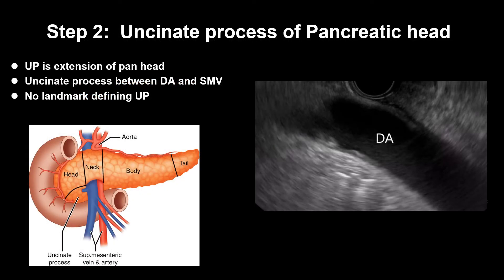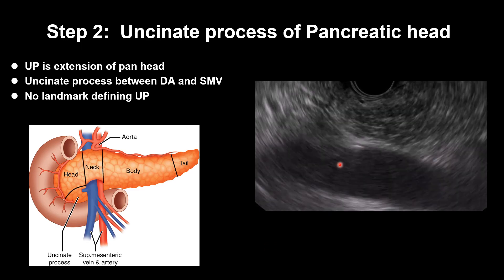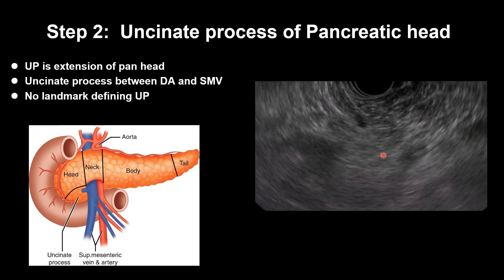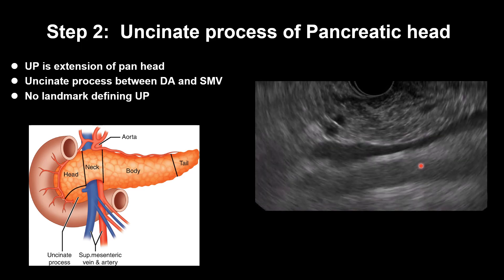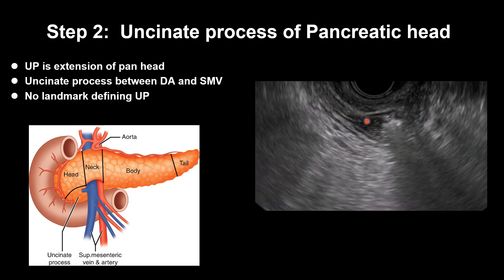Step 2: uncinate process of the pancreatic head. The uncinate process is an extension of the pancreatic head. There is no single landmark defining the uncinate process. Usually, the uncinate process is located between the descending aorta, SMV, and SMA area. The uncinate process is located between the SMV and descending aorta.